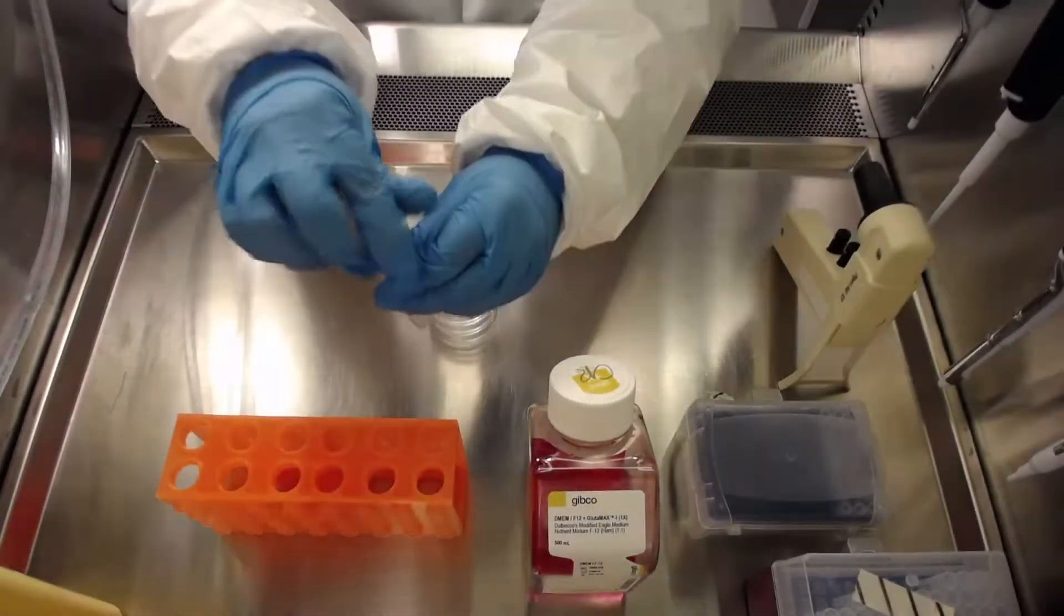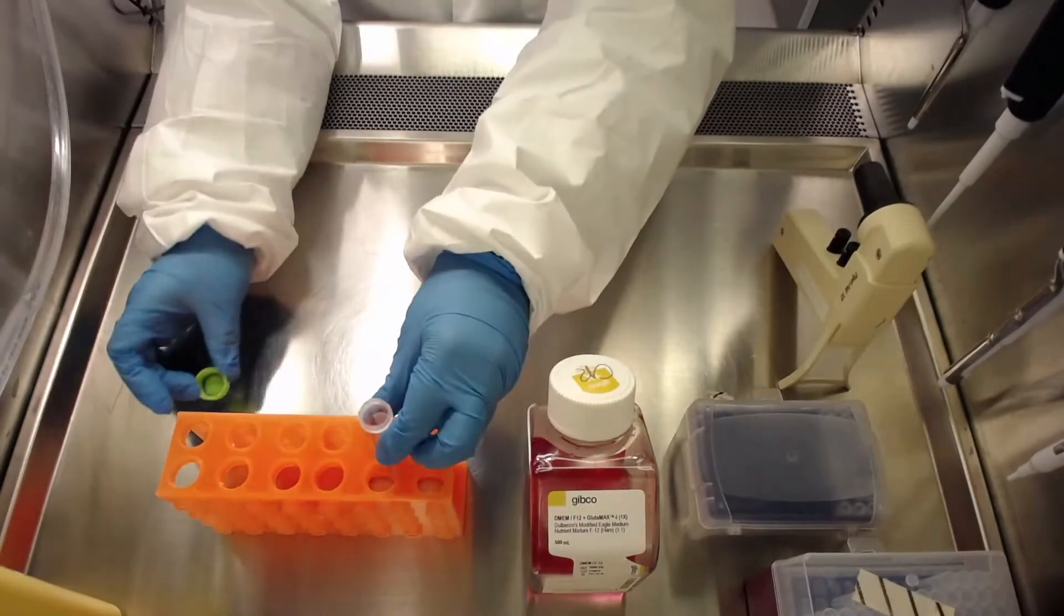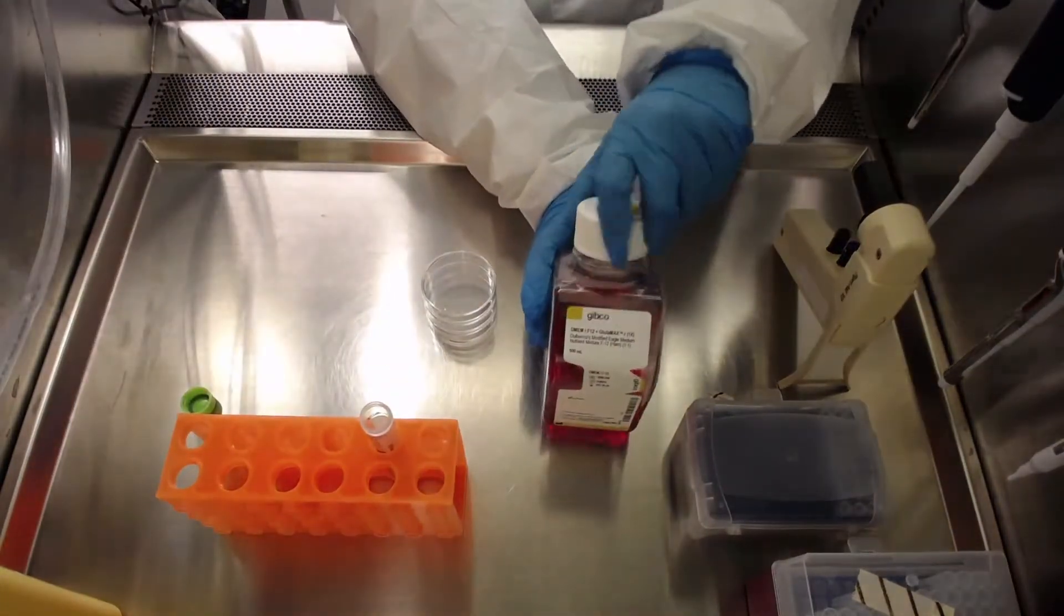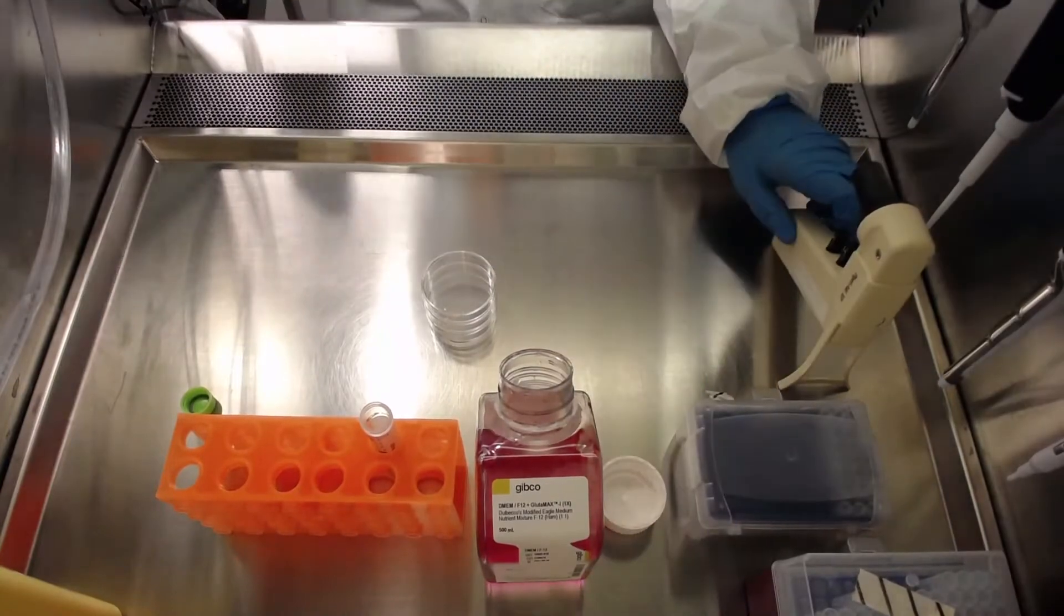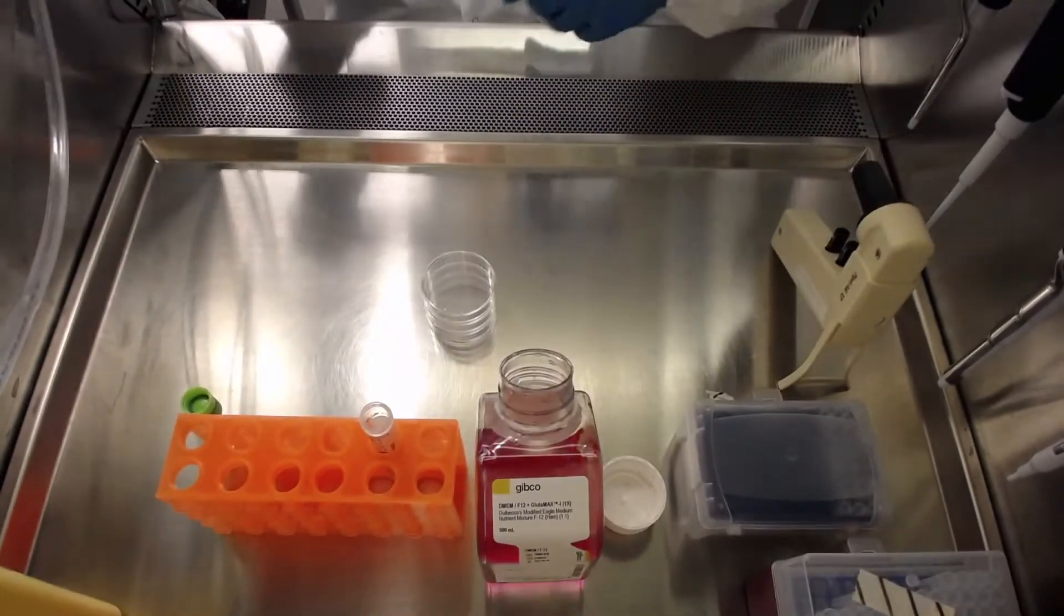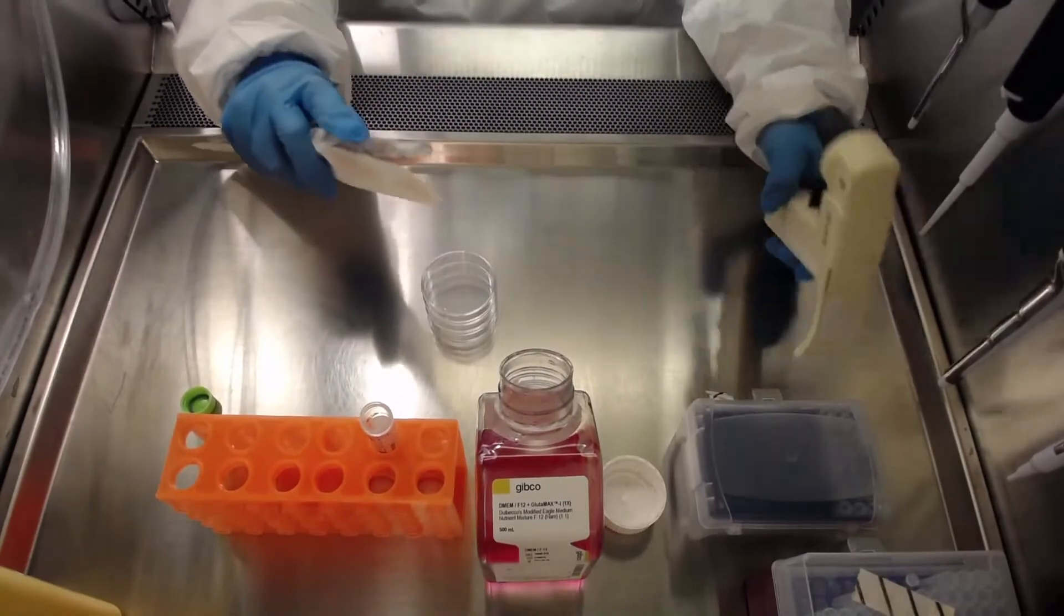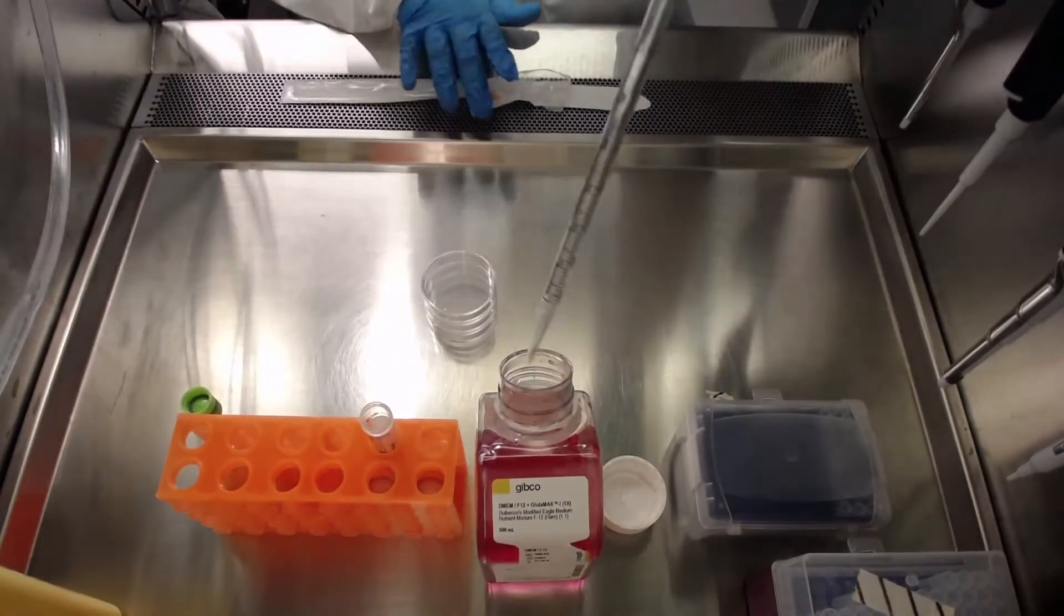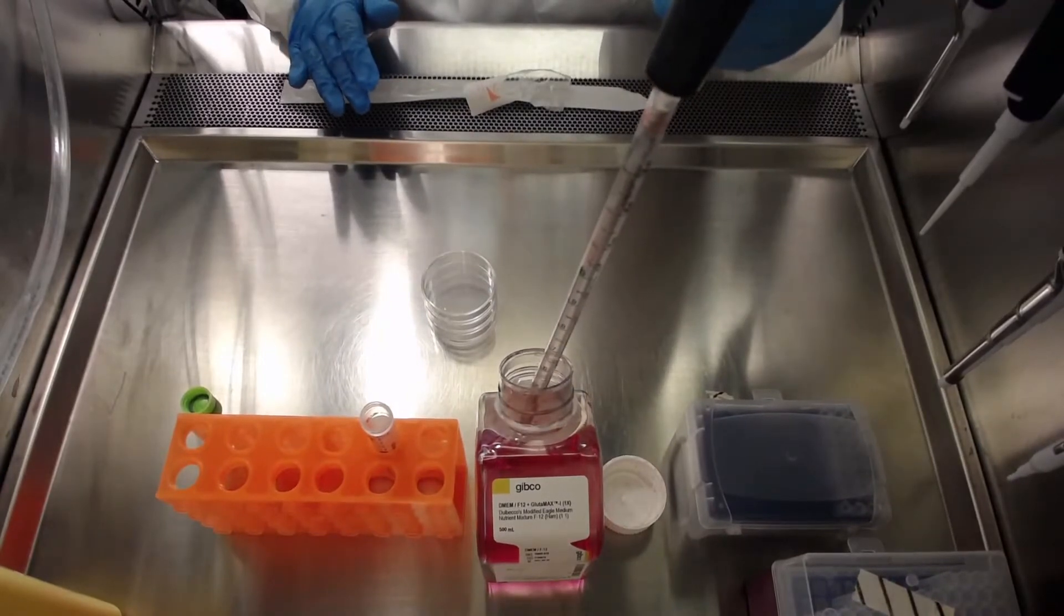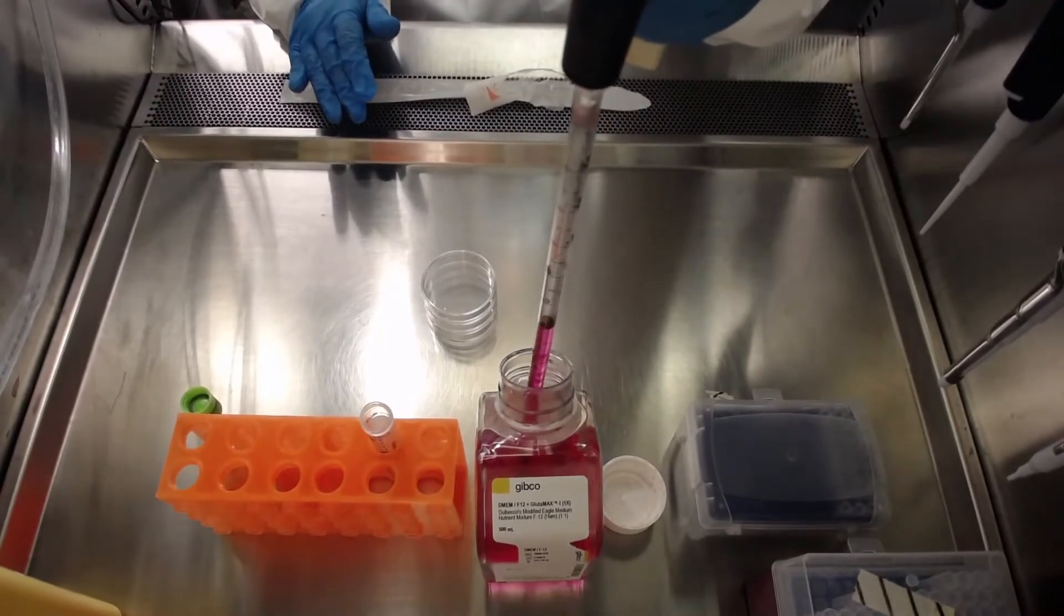Each aliquot of matrigel is dissolved in 15 ml of cold DMEM with anti-anti to reach a 1 in 100 dilution. Open the sterile conical tube and using a sterile pipette, transfer 15 ml of cold DMEM with anti-anti into the tube.